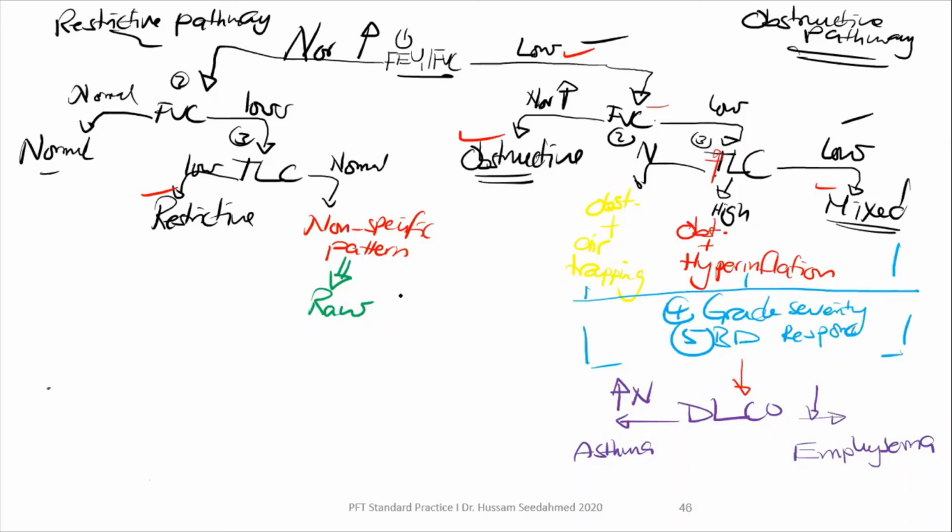إذا لقينا ال airway resistance low, if the airway resistance is low or normal, so usually this is due to chest wall limitation. Chest wall limitation. يعني أنا عندنا non-specific pattern بسبب ال FVC is low. عملت ال airway resistance وطلعت لي low or normal. So this is chest wall limitation. طيب chest wall limitation قاسم بها شنو؟ including obesity, ممكن تكون muscle weakness أو poor test performance.